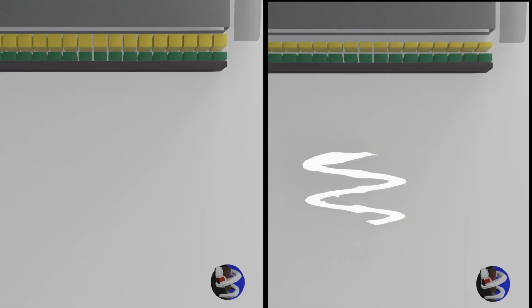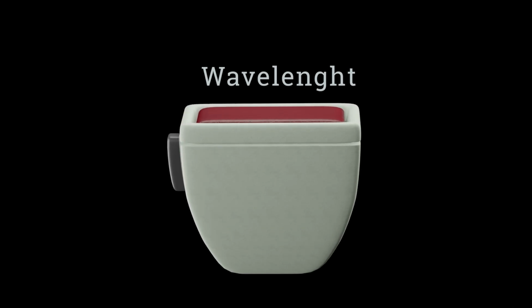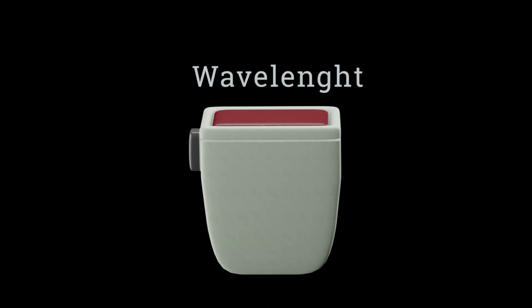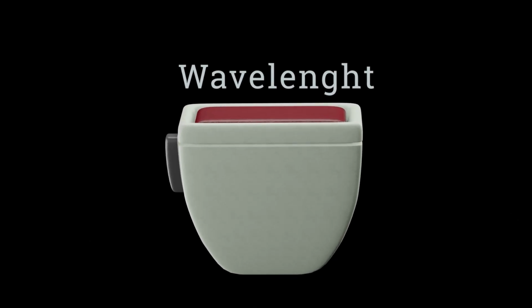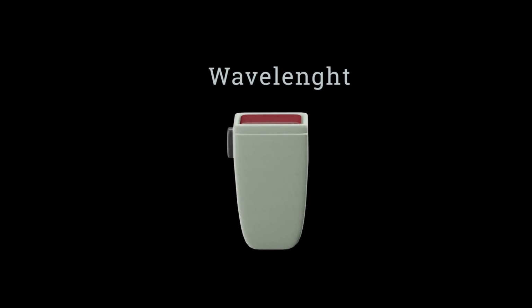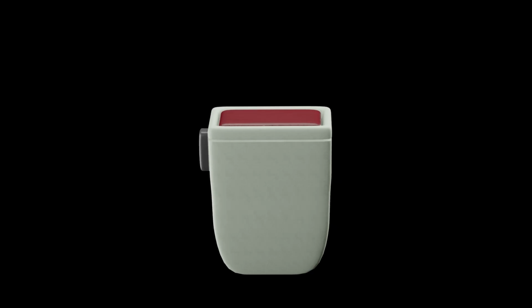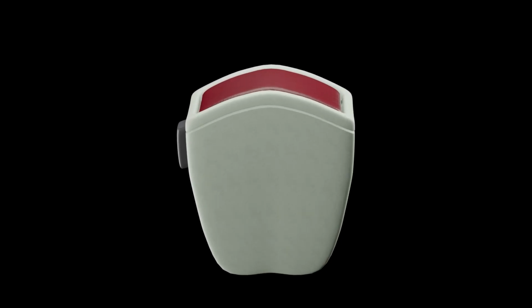So, crystal thickness is proportional to its wavelength and implies that a thicker crystal has a higher wavelength, which will penetrate into tissues more than a thinner crystal. On the contrary, a thinner piezoelectric crystal produces higher frequencies with a lower wavelength. To help you remember, the thickness of the crystal should be proportional to the distance you are trying to scan. Bigger crystal, bigger waves, more distance.